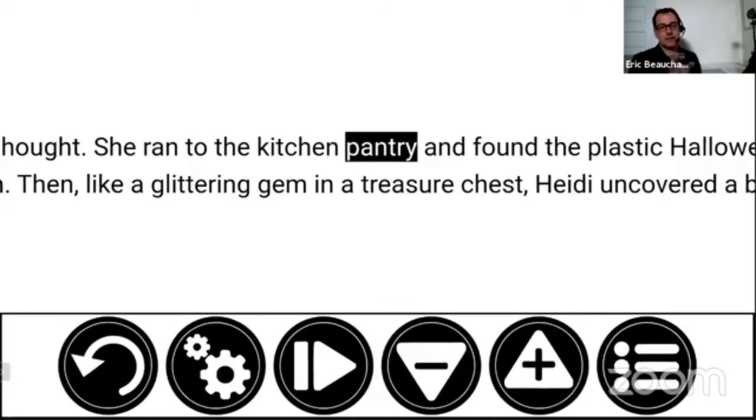And if that book has text on the graphic and it was converted to text and not stuck as an image, it will read it out loud. So it all depends on the book. Very good. So if there are no more questions, I can go to the apps.